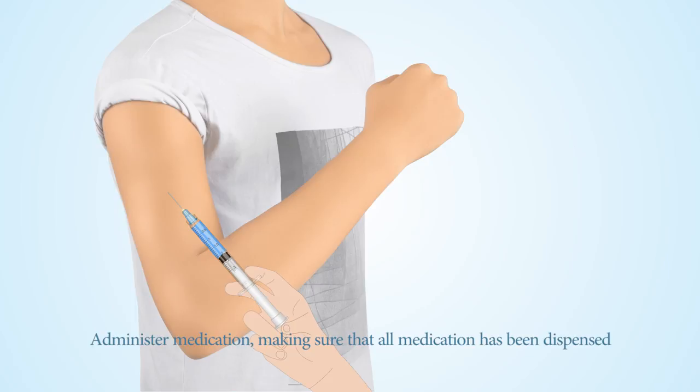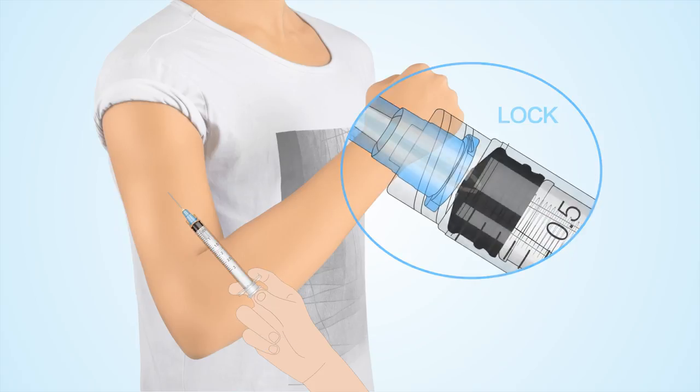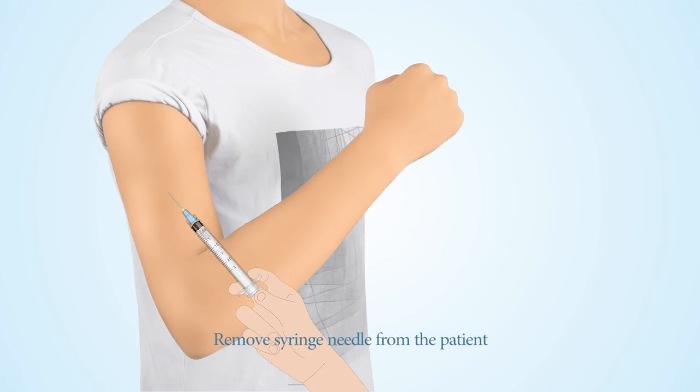Administer medication, making sure that all medication has been dispensed. Depress the plunger until you hear one click. Remove the syringe needle from the patient.